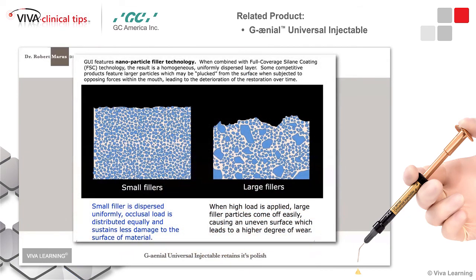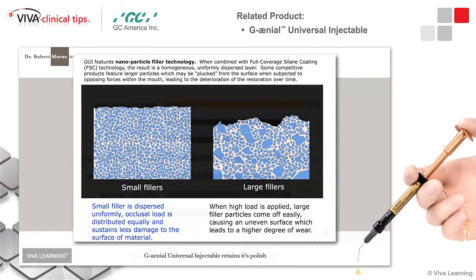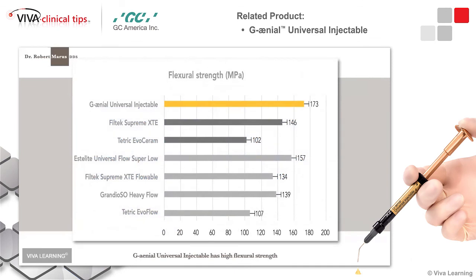And that's what I'm saying. You're dealing with something that's uniform particle, but they're nanoparticle. Look at the strength. It's up there comparable with compactable or traditional composite.